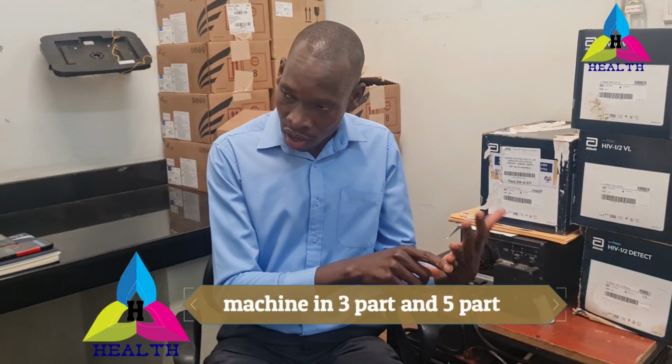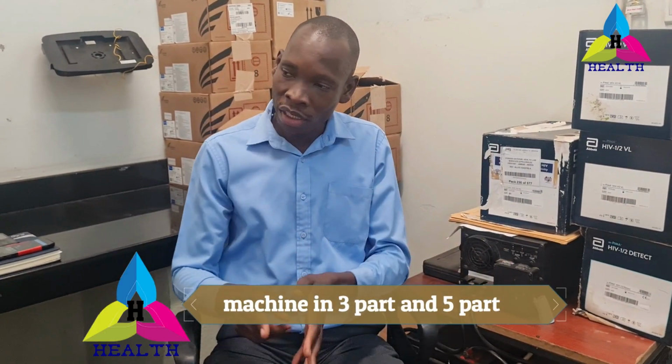So we have 2 types of machine: the one which can do the 5 parts, and the one which can do the 3 parts. For the 3 part, it divides the 5 cells into 3. The ones that are granulated are identified differently. The ones that are non-granulated are also identified differently. And then monocytes, since they are big, are identified on their own. So that makes the 3 parts. Oh, that's why they call it 3 parts.